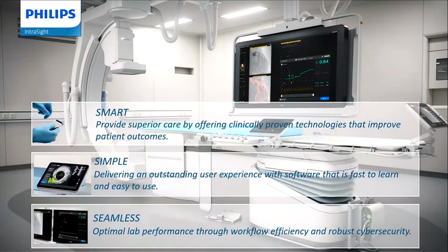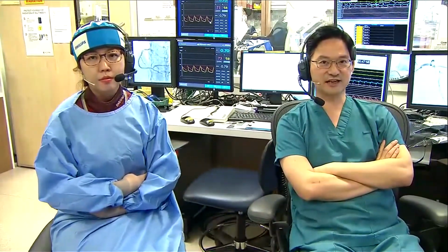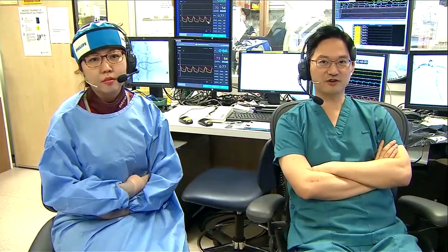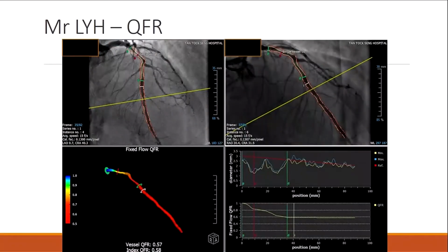And beforehand, we also did some angio-based QFR on this case. Can we show, do you have the QFR results there that we can show them? If not, okay, so this is essentially an angio-based QFR, and you can see the QFR reading here is very abnormal at 0.57. Okay, so maybe we can start the case. Deborah, can you go into it and help out?